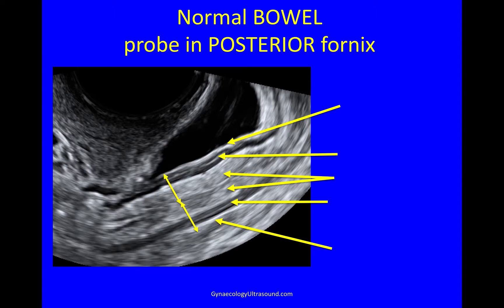Looking at normal bowel first — the probe is in the posterior fornix. You can see the normal posterior vaginal wall and the normal overlying peritoneum; it's not thickened. This is the pouch of Douglas with a tiny little bit of fluid. You can see that this white layer is the serosa. The dark layer here with the white line in between is the muscularis layer — the white line is where the outer longitudinal and inner circular fibres join each other, giving a little white line of connective tissue, which confirms that's the muscularis.